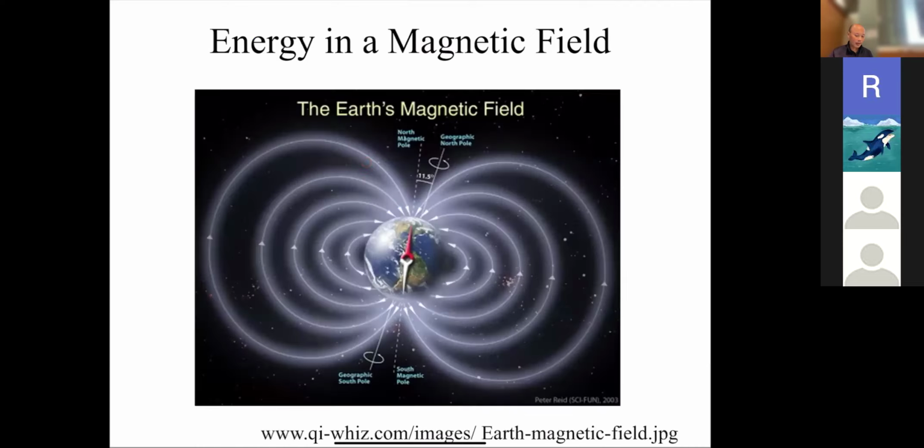Okay. And everyone has experienced this. I assume everyone knows what a compass is, right? And so every time you use a compass needle, essentially this is what's happening, right? The needle has a magnetic moment, and its lowest energy state is when it's aligned with the main field. If you could turn the compass needle so it's anti-aligned, it would just go back to its lowest energy state, right? So it has a preferred state. So same thing when you put a human body into a magnet, the protons will now have a preferred orientation.